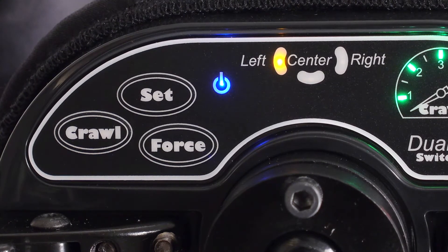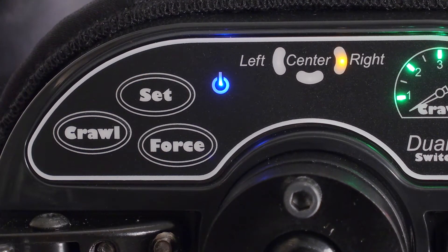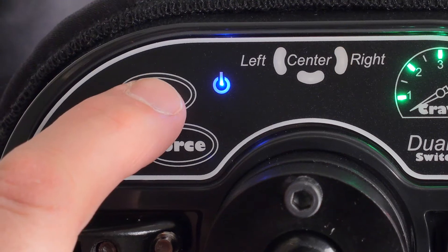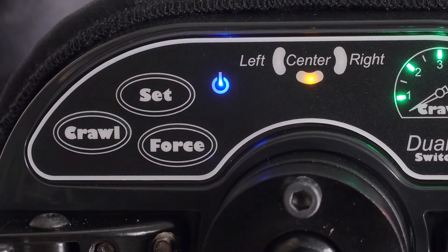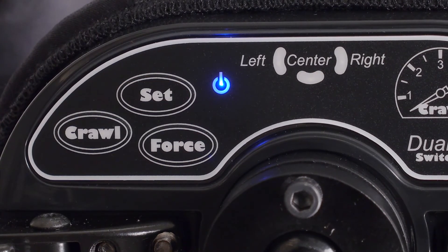In this programming mode, the left pad can now be programmed. If Set is pressed again, the right pad starts flashing and is now programmable. Hitting Set a third time moves the programming functionality to the back pad, and a fourth hit returns the headrest to normal operating mode.